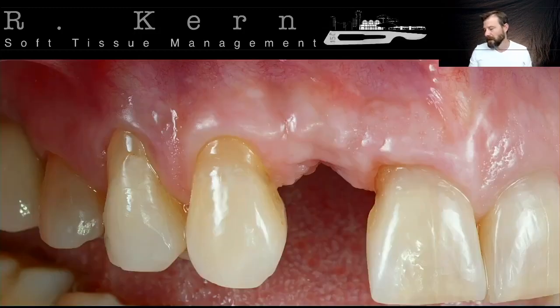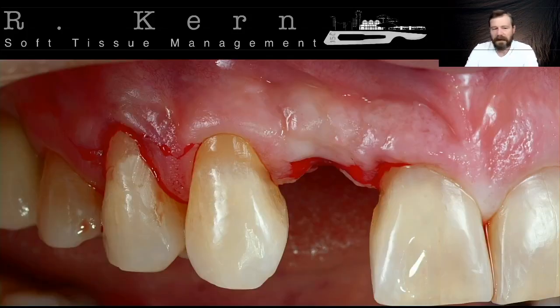Good. So after 3 weeks, I have the soft tissue recovered for the removal of the crown, and I can start my soft tissue grafting here. We can apply tabletop option, we can apply pedicle here, but I'm going to tell you something, okay? My first option is the pedicle. Why is that? Better nourishment.